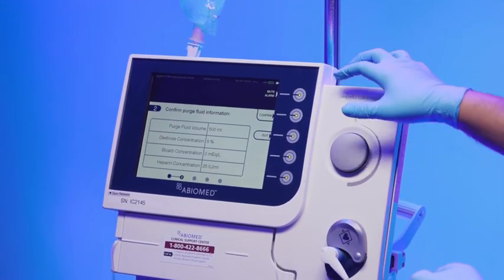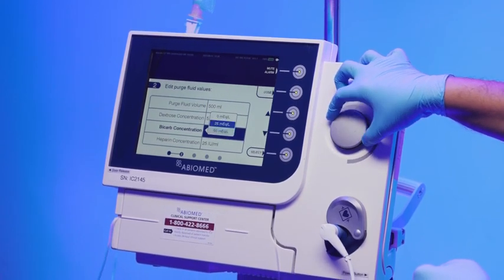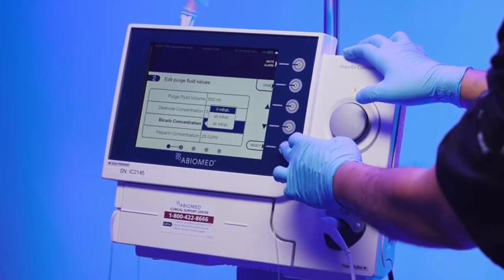Enter the purge fluid information. If the values need to be adjusted, press the edit soft button. If the default values are correct, select confirm to verify these values.